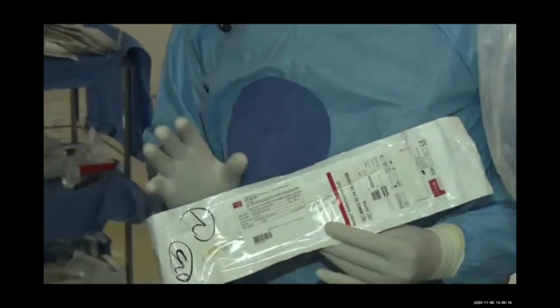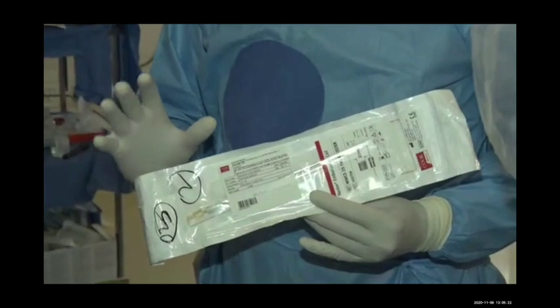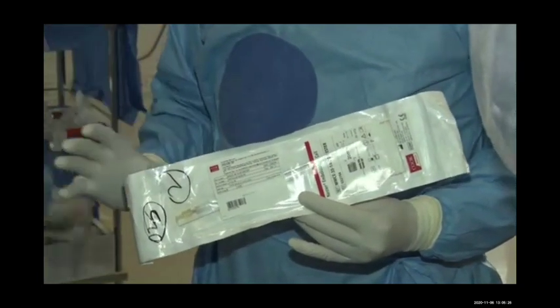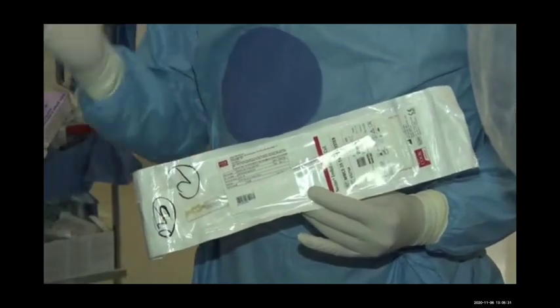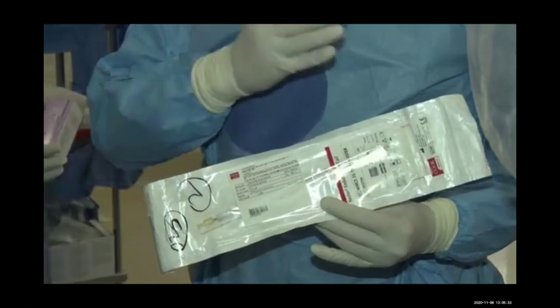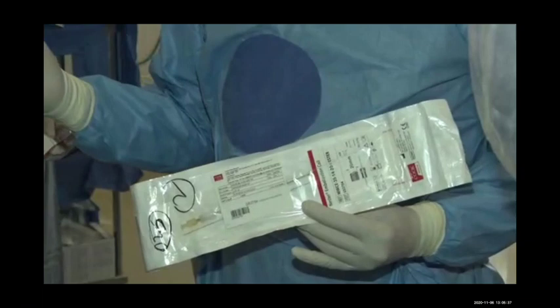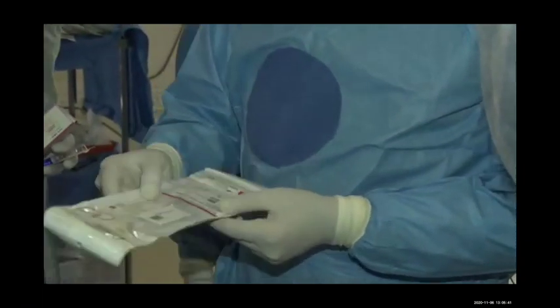That is very important. You should either do a pre-procedure CT scan to know about the intramucosal varices size, or you should do endoscopic ultrasound. Because if you choose a small size of the coil, then the risk of migration will be high. So you should have the entire range of coils. We keep from 6 millimeter to 2 centimeter size, the entire range of the coils, and they are available with the name of Nester embolization coil by Cook.